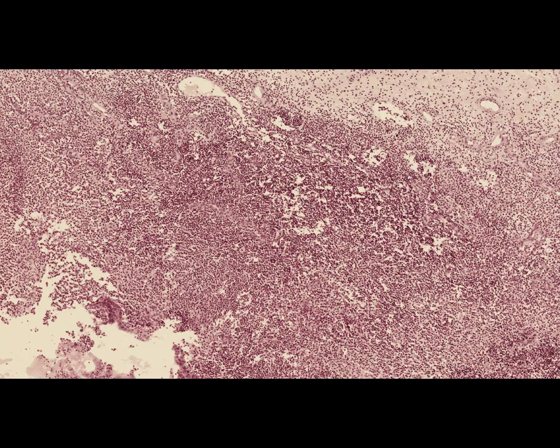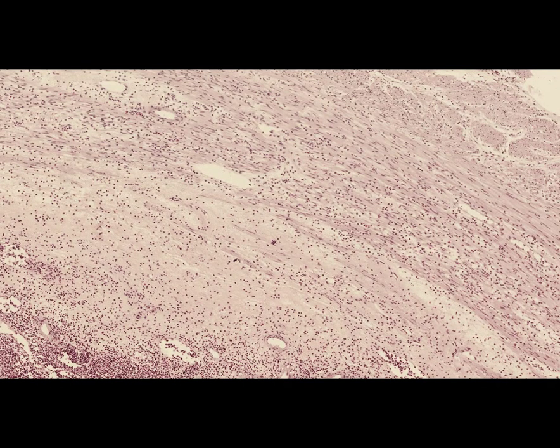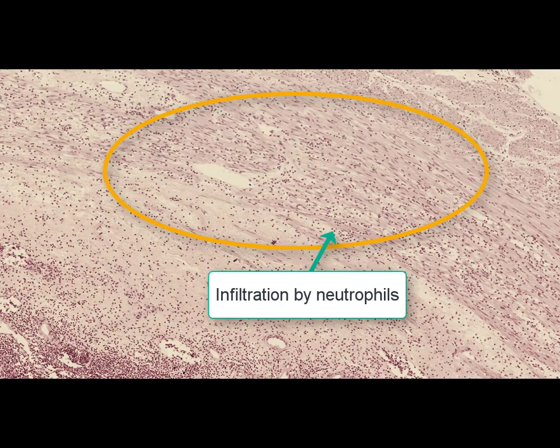Due to the phlegmonous nature of inflammation, neutrophilic infiltration is also present in the muscular layer as well as in serous layer.